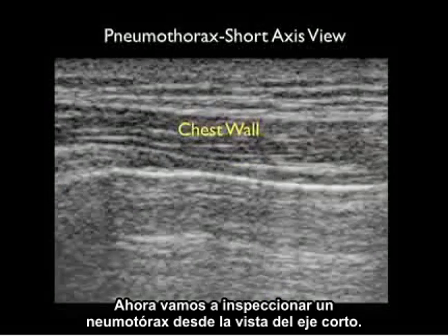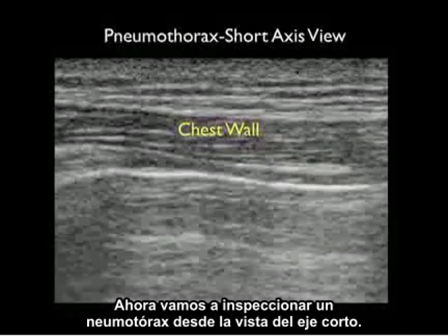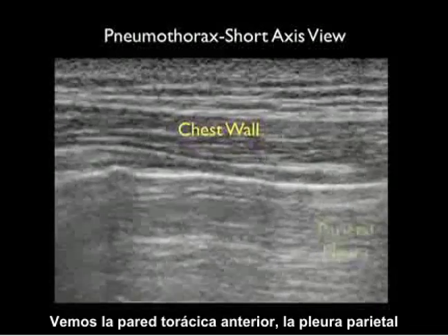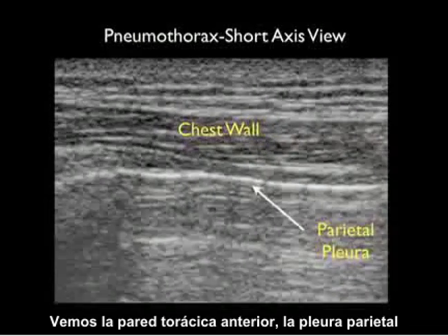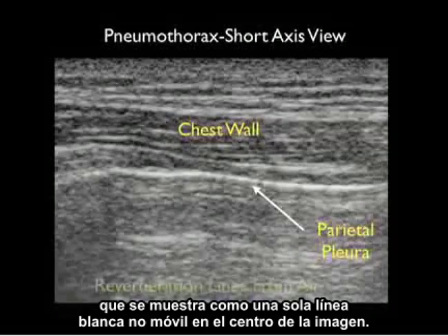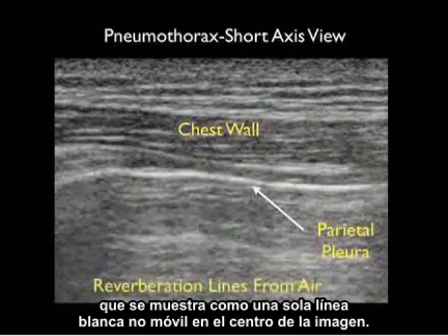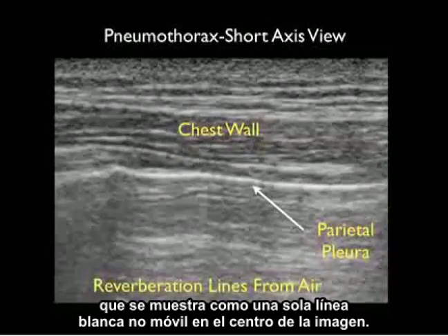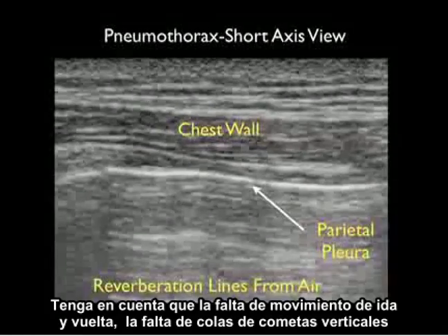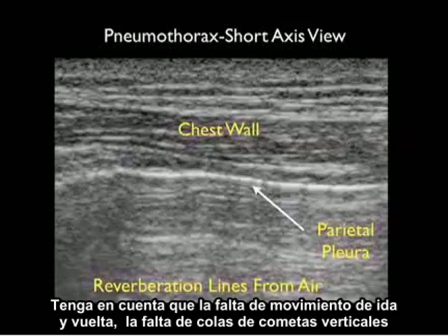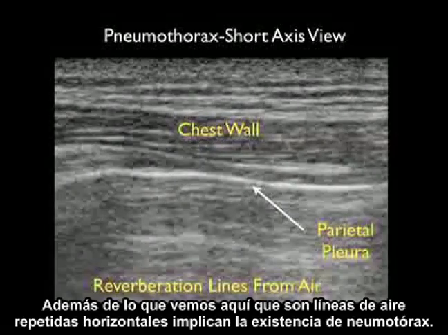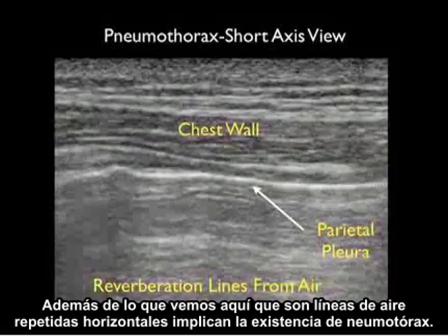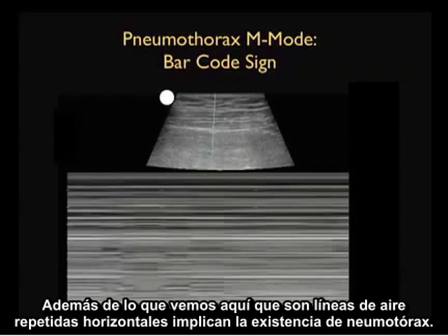Now let's inspect a pneumothorax from the short axis view. We see the chest wall anteriorly and the parietal pleura shown as a single non-mobile white line in the middle of the image. Note the failure of movement back and forth, the lack of vertical comet tails, and we see repeating horizontal air lines from the pneumothorax.